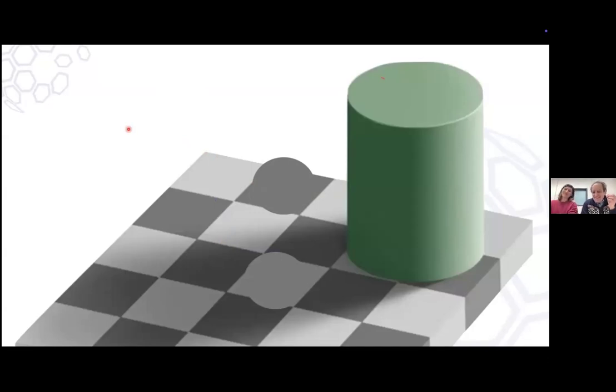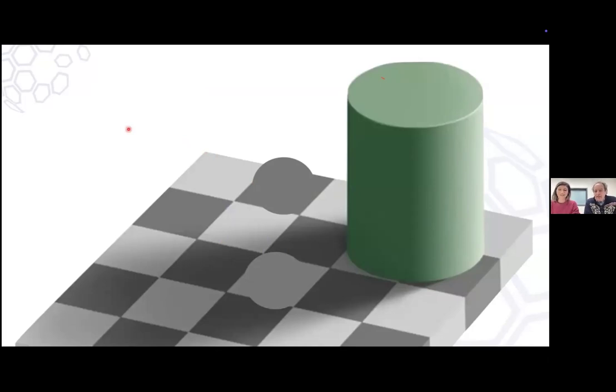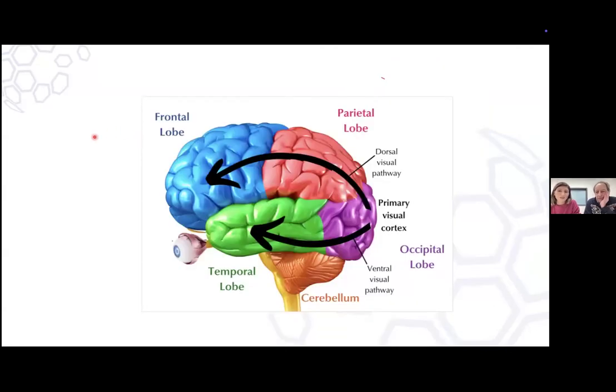I must confess, I didn't believe it either, but he was doing it in slow motion with me, and yes, this is true. It's not a trick. I'm taking it there and I put it here. Indeed. So what is this? It's that our brain doesn't want to upset us. It needs to portray reality as well as possible, and it knows that must be a white square. So it's telling me it's a white square, even if it's not a white square. So be careful, because sometimes your brain tells you there is a line of staining, and you really need to question yourself. Is that staining? Indeed. That's why we need to filter.